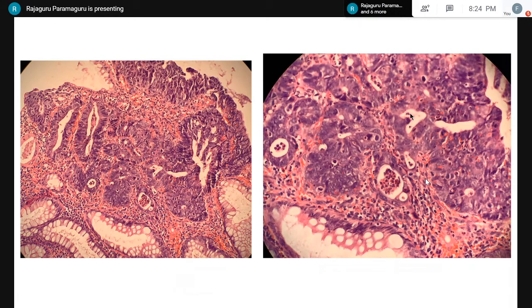If you get a lesion like this, it is always better to do multiple deeper sections to study the entire polyp. We might not know if this polyp will be seen invading the muscularis mucosae as well. In that case, it is going to be called a pT1. And it is different from a high-grade dysplasia.